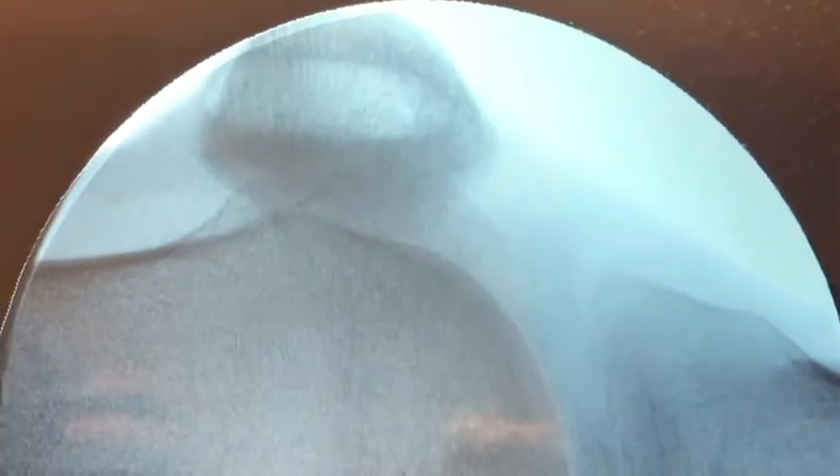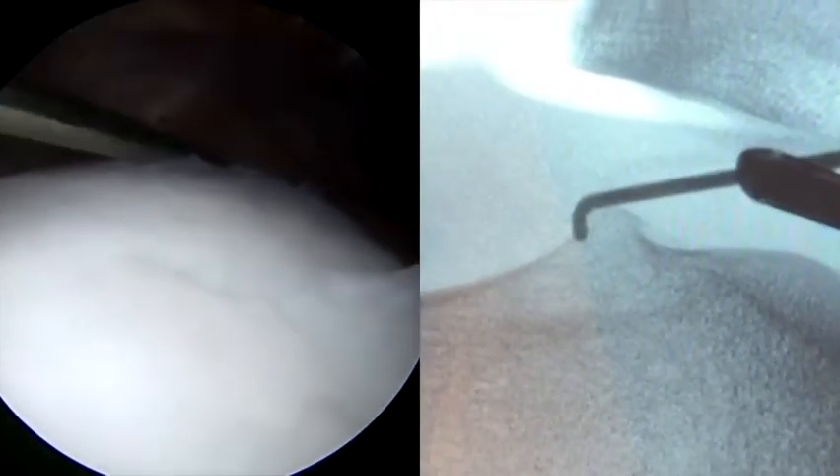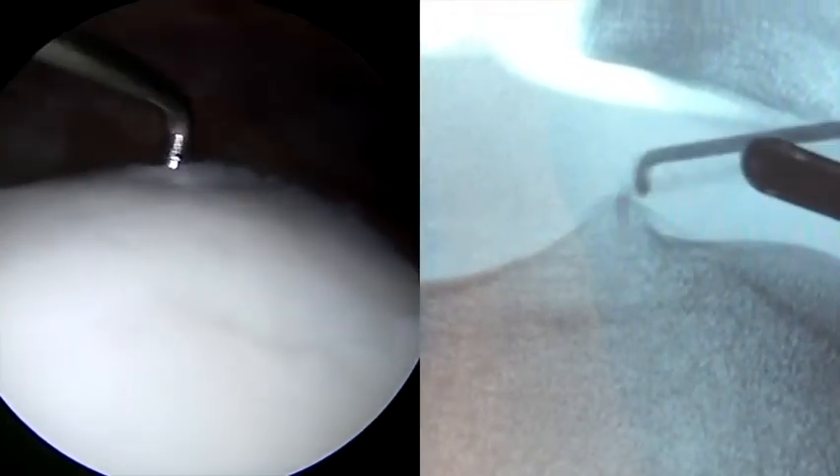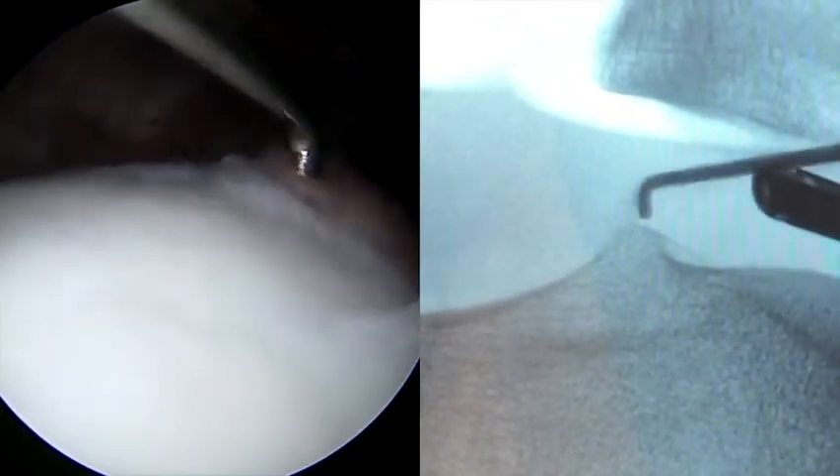We then obtain a perfect lateral x-ray where on live fluoroscopy we can see the prominence of this bump proximally. We then find the associated area in the arthroscopic view that correlates with the fluoroscopic view so that we know where to perform our resection.